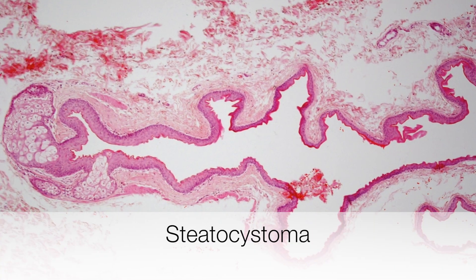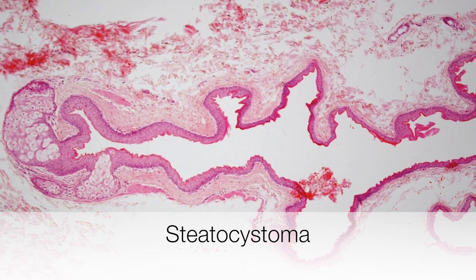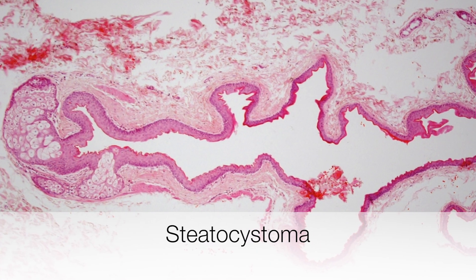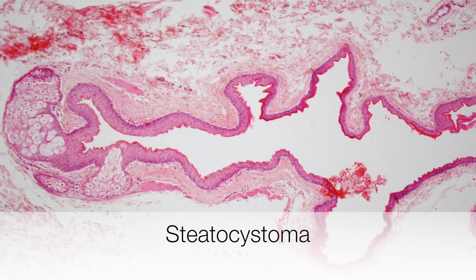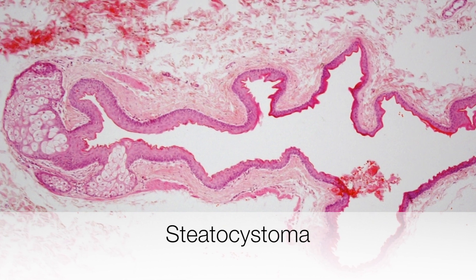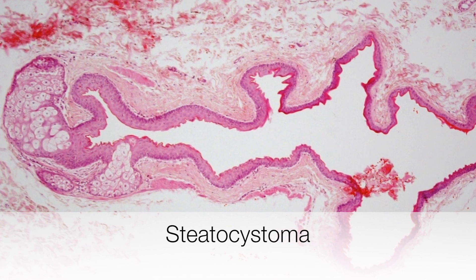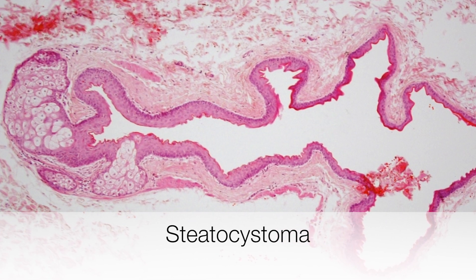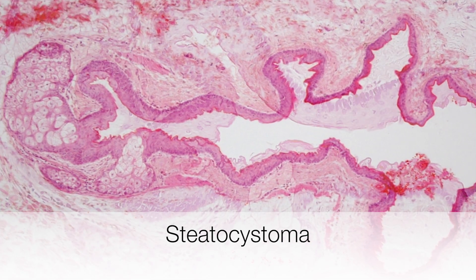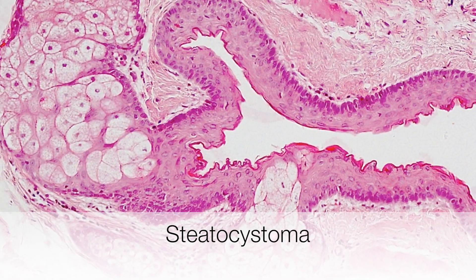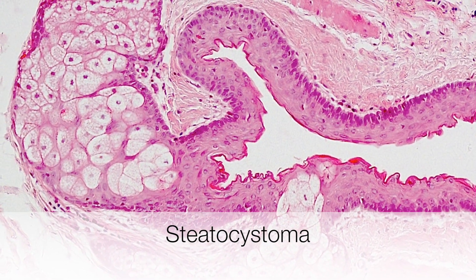The cyst has a rather corrugated appearance and is lined by stratified squamous epithelium. At the left side of the picture are small sebaceous glands that form part of the cyst.